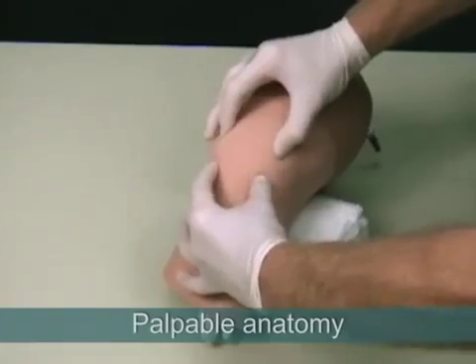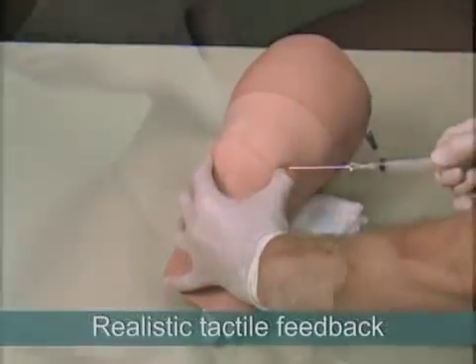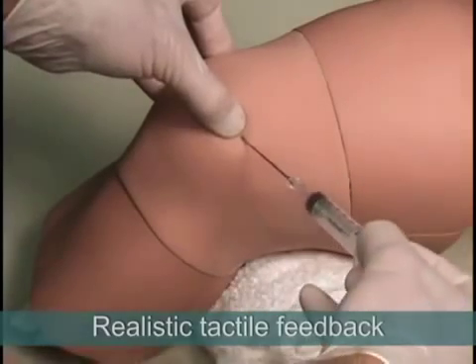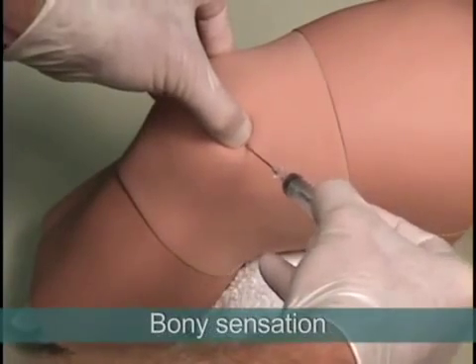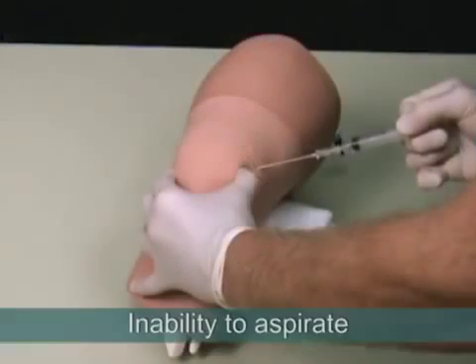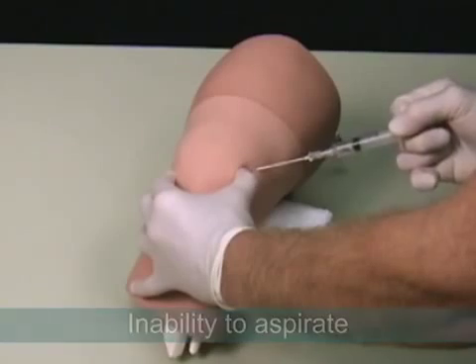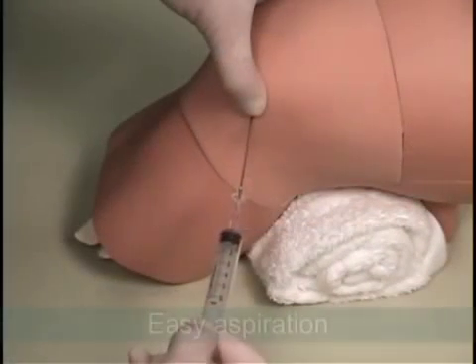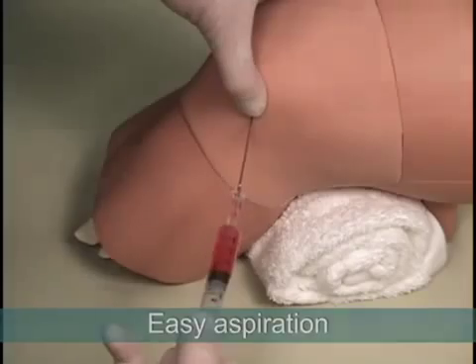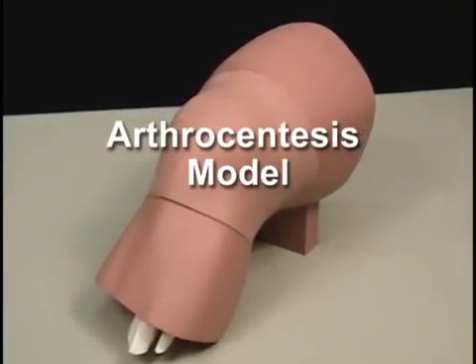During the procedure, the anatomy is palpable and the model provides a realistic needle response. The tactile feedback includes sensation of bony contact if the needle hits the patella or the femur, inability to aspirate the syringe while the needle tip is in the soft tissue superficial to the joint capsule, and easy aspiration of joint fluid when entry has been achieved.